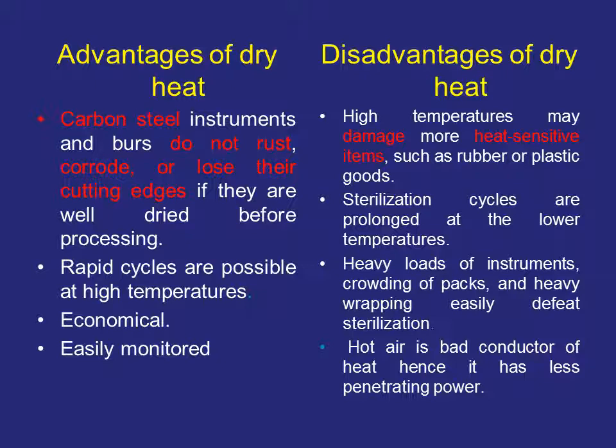Heavy loads of instruments, crowding of the packs, and heavy wrapping all hinder sterilization. Also, hot air is a bad conductor of heat, so it does not give good penetration for all the surfaces of the instruments.